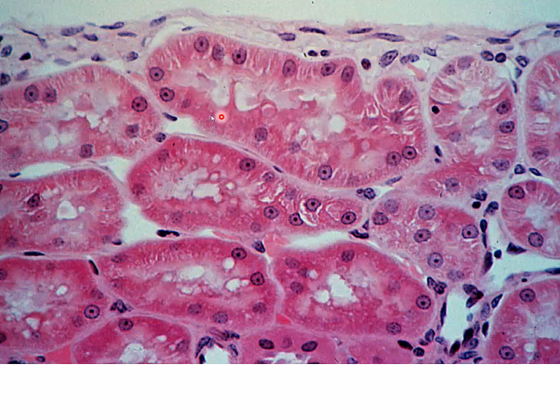these cells. But notice, you don't see every nuclei. The nuclei that you do see have this nice dark nucleolus, and we don't see the lateral cell boundaries. Lumen is occluded. Very characteristic of what we see with proximal convoluted tubule.